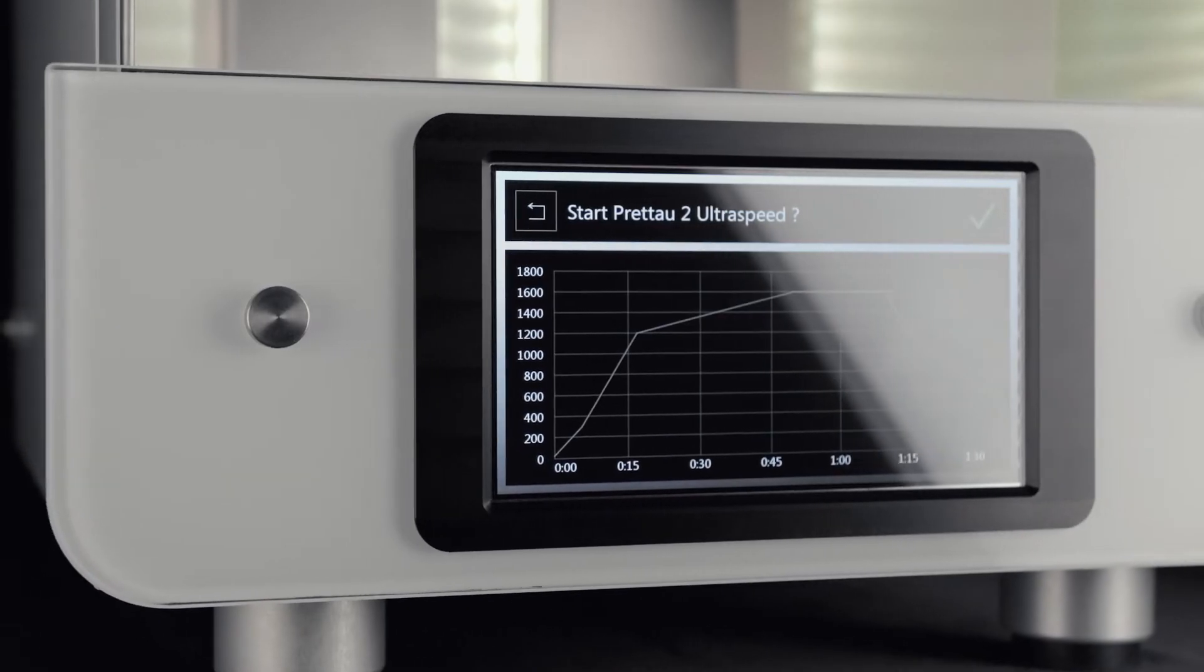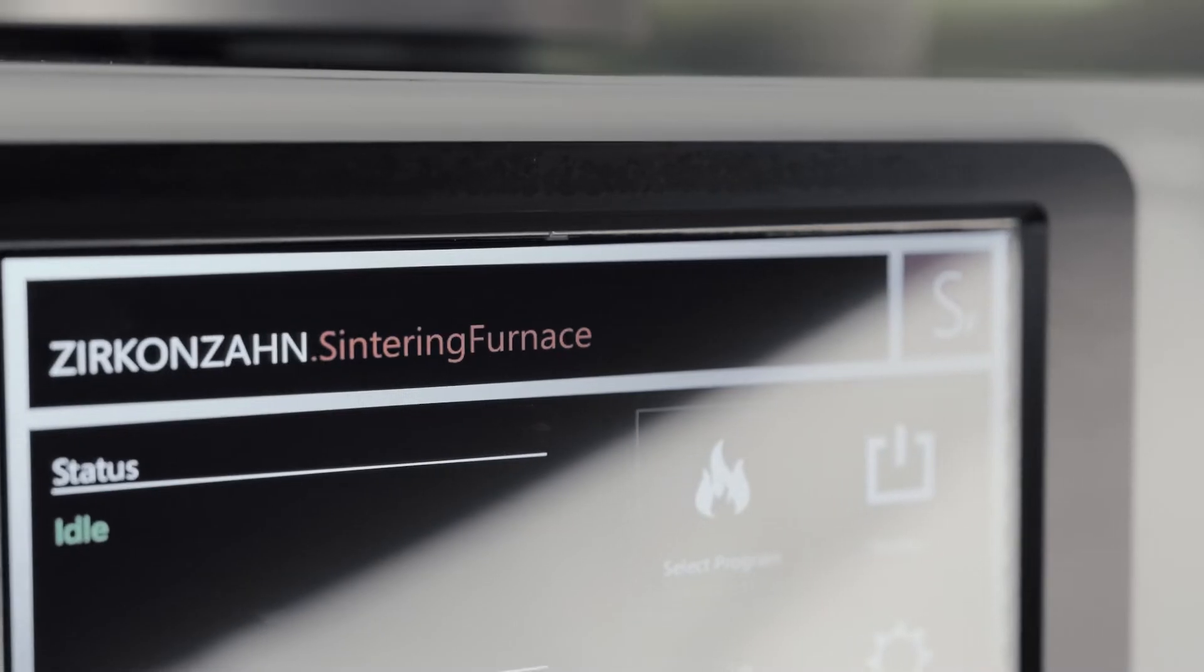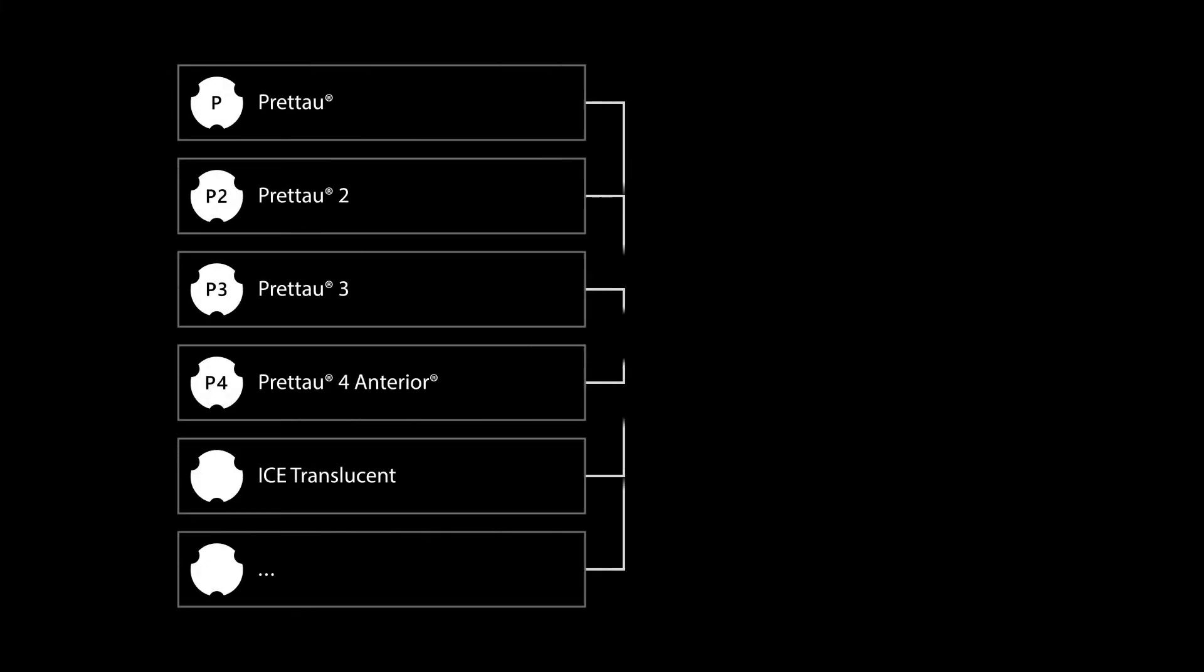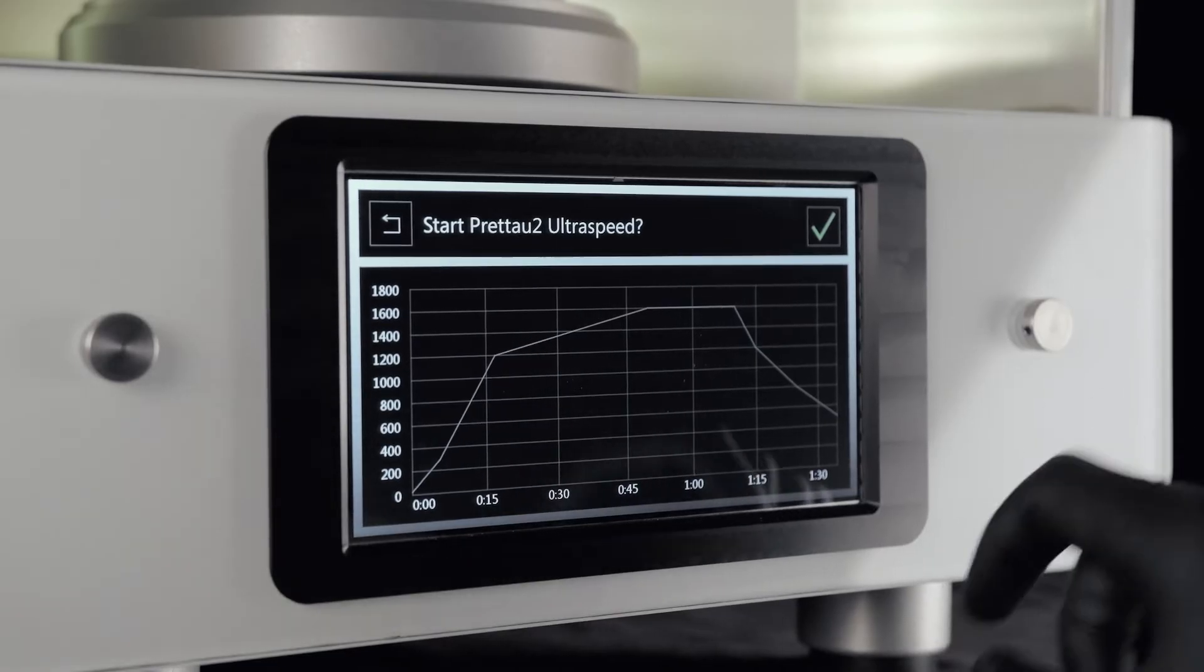Thanks to the 7-inch touch display, our Zirkonzahn Turbo is extremely easy and intuitive to use. The newly developed and redesigned software allows you to select both the desired material and program speed, and finally to start the sintering program.